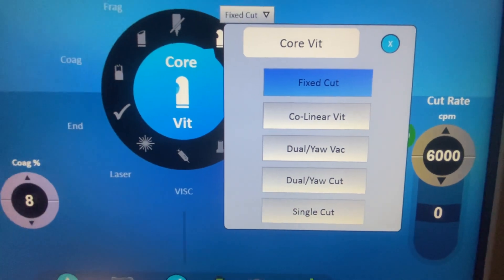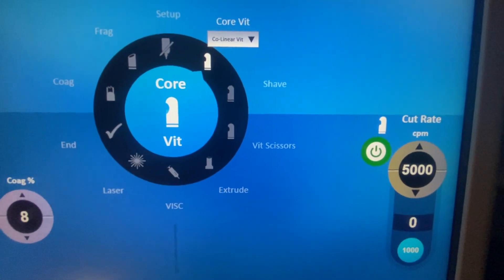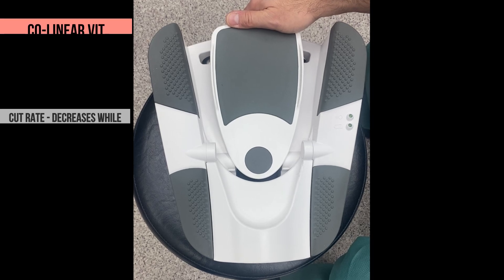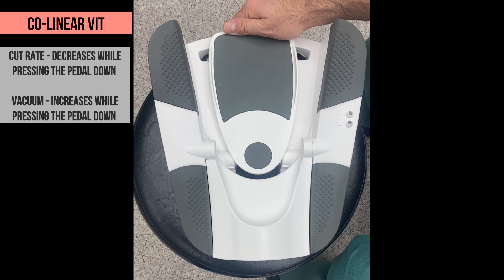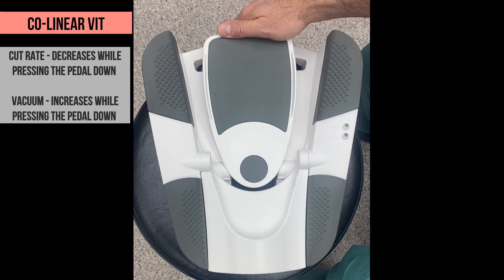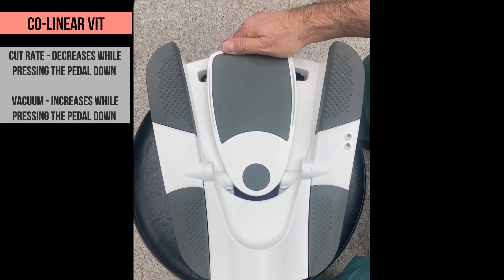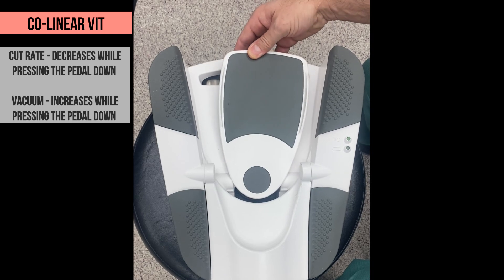The next sub-mode is called linear vitrectomy. In this sub-mode, both the cut rate and vacuum change, and for both, the highest and the lowest value are set in advance. At the starting position of the pedal, the cutting is at its highest value and the vacuum at the lowest. Then, while pressing the pedal down, the cutting gradually decreases while the vacuum is increasing. Then again, the right side click turns off the cutting and leaves on the vacuum. One more side click turns on the cutting back.